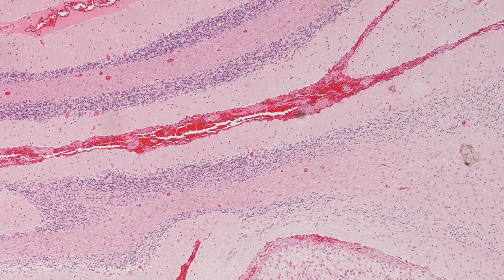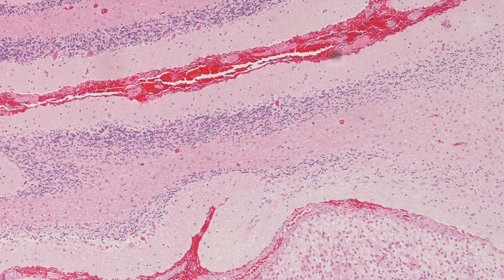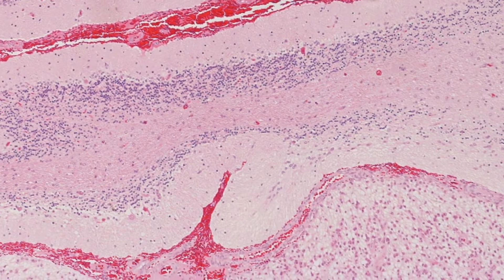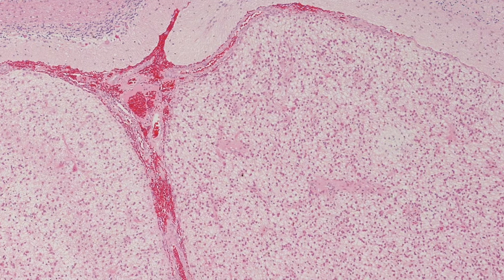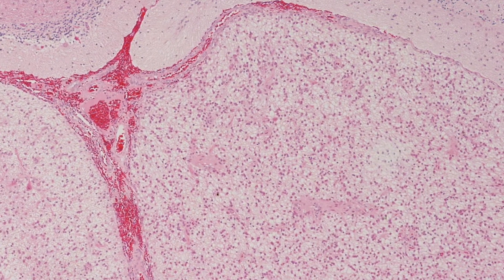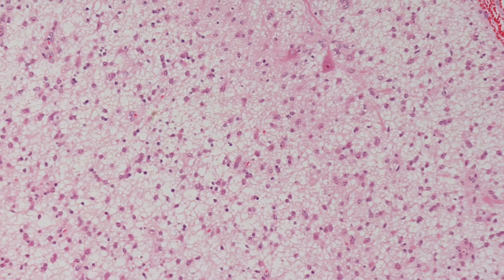Here is the adjacent cerebellum and we are panning into the tumour. Here you can see the tumour itself. Note the sharp boundary between the tumour and adjacent cerebellum. Here is a high-power view of the tumour.